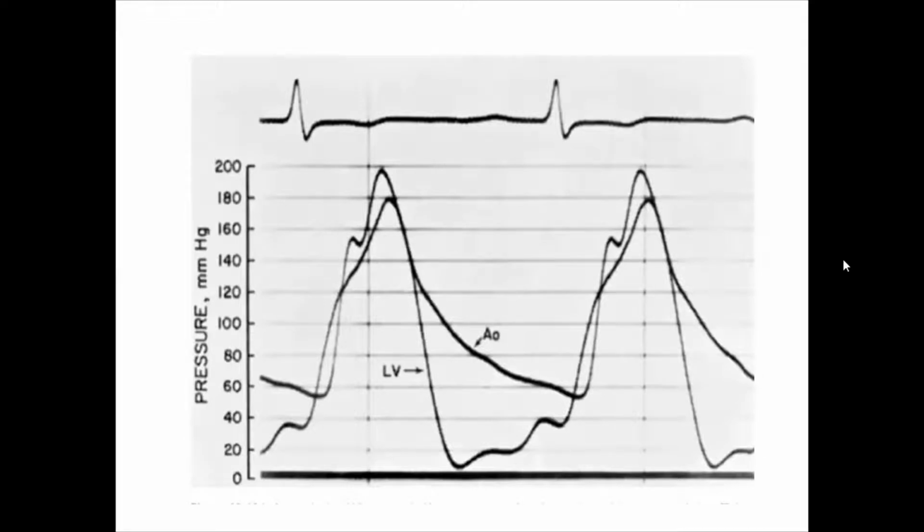Simultaneous hemodynamic tracing of LV and aorta in a scale of 0 to 200 with ECG tracing, in sinus rhythm because there is a P wave here. Okay, good.